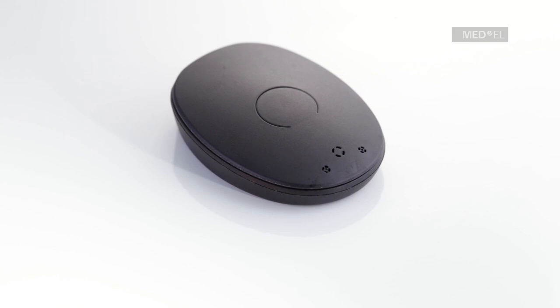If the optional status light is activated, a short blue blink will blink every 3.5 seconds to show that RONDO 2 is working properly.